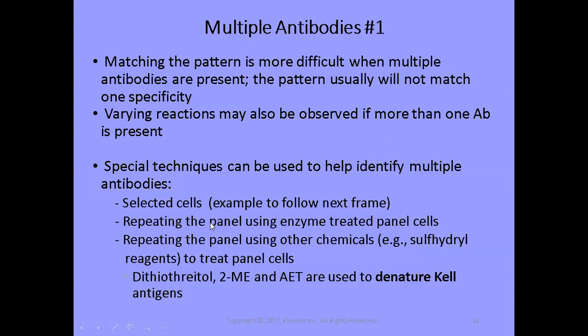We could repeat the original panel that we did, however, this time using cells that have been enzyme treated. And hopefully you remember that enzyme treating our panel cells can enhance certain antigens like RH antigens or Kidd, but also could destroy or eliminate certain antigens such as the Duffys, M and N. That was hard for me to say.